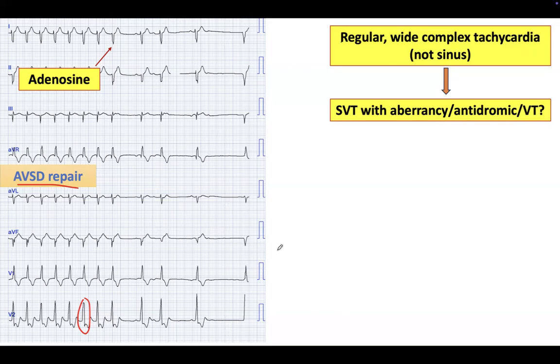Heart block? Looks like heart block, 2 to 1? Yeah, look carefully. What's this? P, right? Retrograde P? Well, it's upright in lead one, lead two, not retrograde. AVL positive, AVF positive. So sinus P, right? Most likely, right? And this is right. Regular R-R.